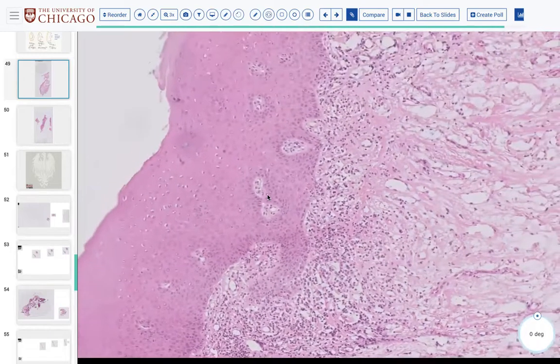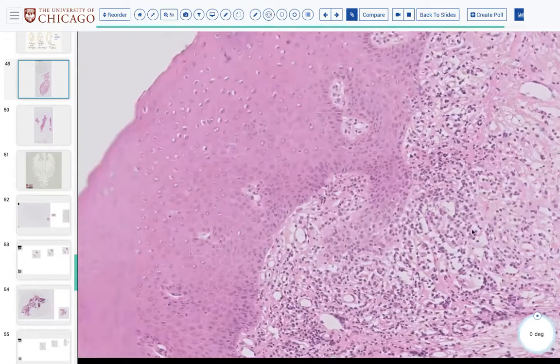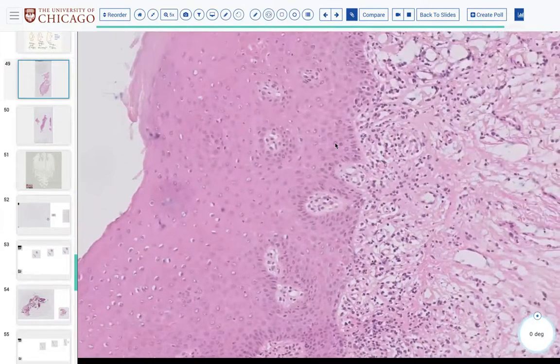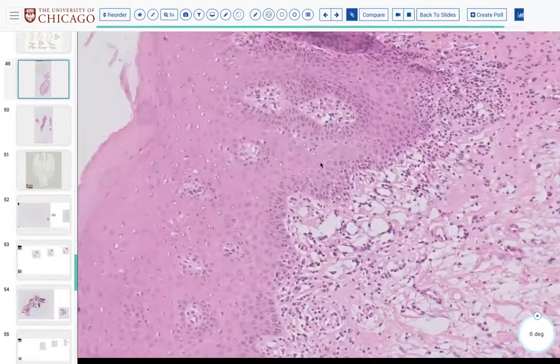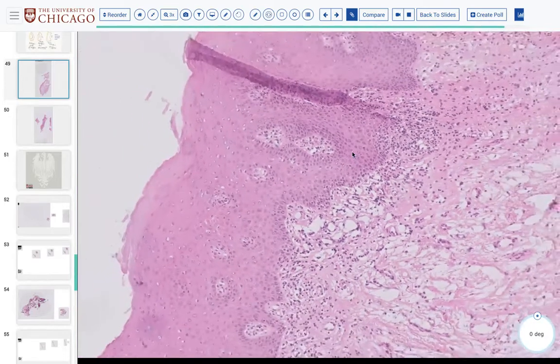Does the water line happen only when you export the slide, or does it also happen when you're viewing it in the Philips online viewer? My issues were just within the viewer. I didn't export it. Jasmine's saying it's a discrete water line. It happens when I export the slide to Path Presenter. It's just there. So it's a problem with the scanner.